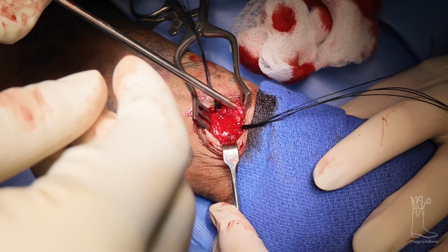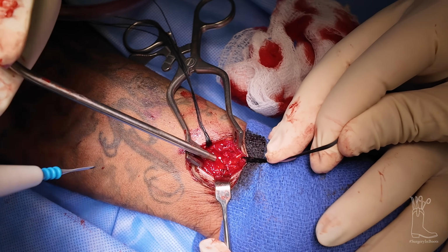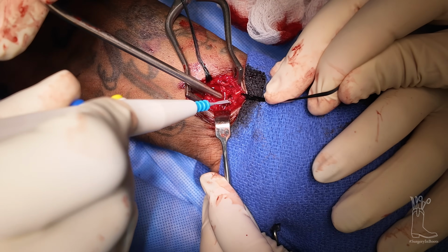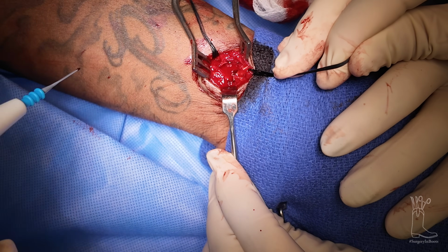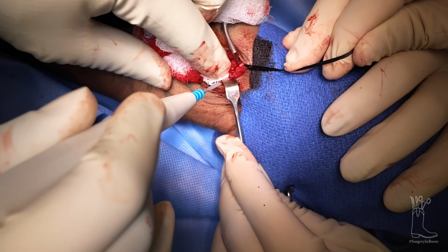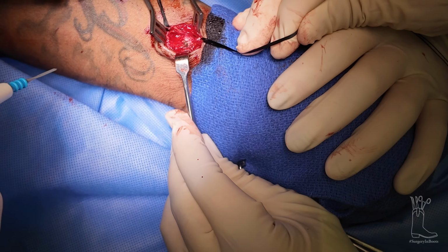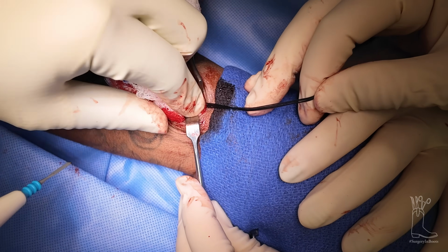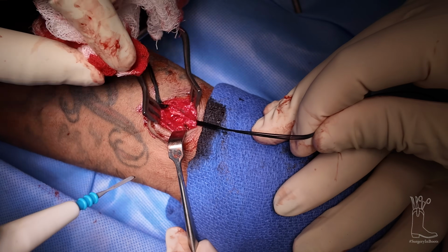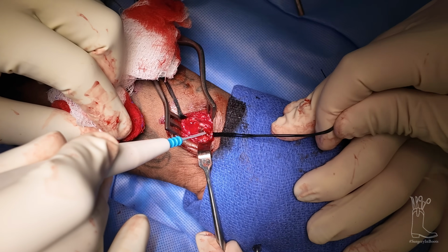Cautery for a sec. The fact that it's not jumping is good, means we're not close. Oh, there he is. That's it. You go deeper than this, you're going to get into the radial or ulnar artery, the supply, bottom. But we are not going to the bottom.